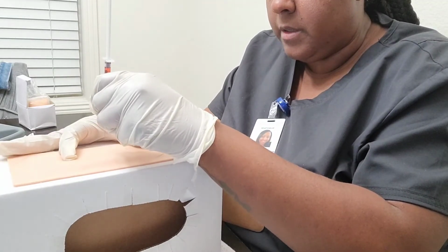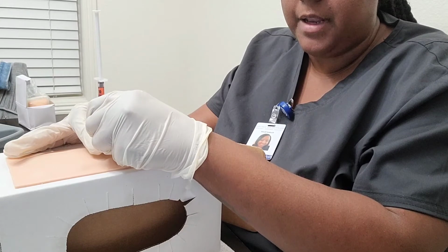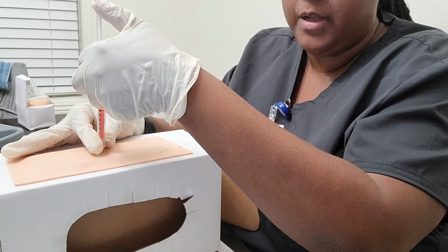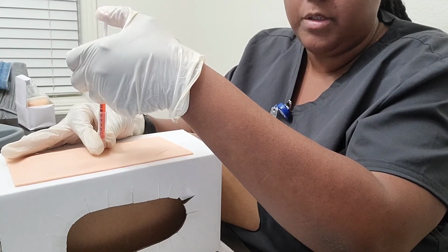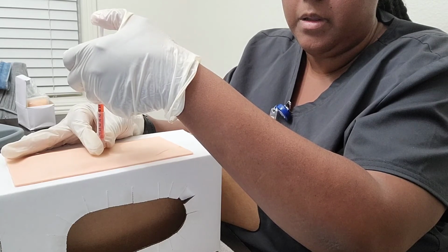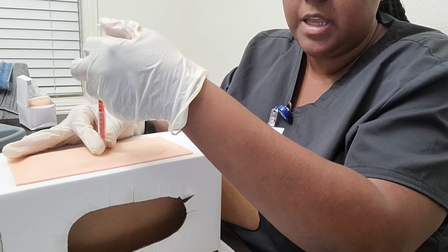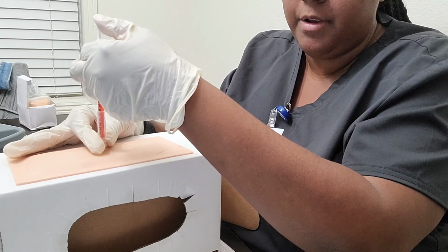And just like this. Okay. And then I'm going to take my non-dominant hand to stabilize it and move the dominant hand to the end of the plunger to avoid moving the syringe. And then I'm going to administer the injection. And I'm going to do it slowly. I'll pull back on the plunger for 5 to 10 seconds. If no blood appears, inject slowly at the rate of 10 seconds per ml.